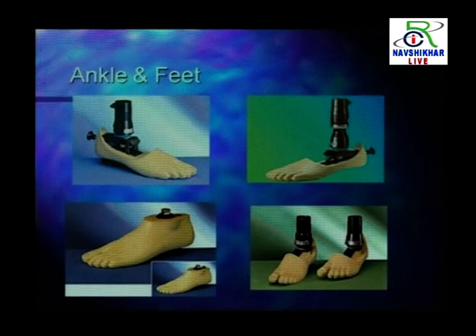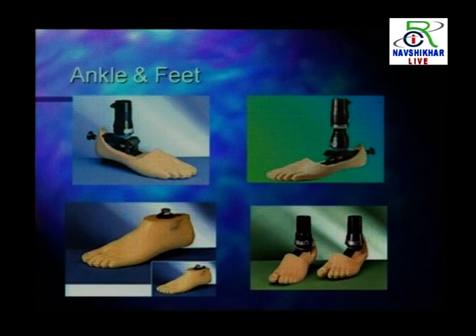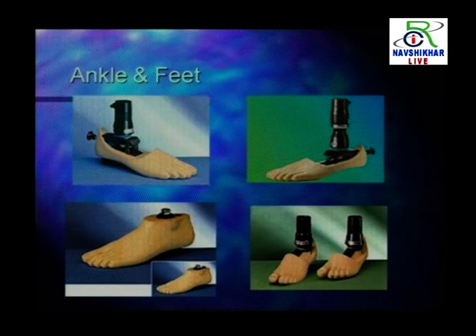I was talking about the energy saving feet. Different manufacturers make them according to their own designs. The first one is a dynamic kind of foot with an integrated ankle, and inside there is sometimes a spring coil that gives extra push to the patient when moving. So it gives a pushback, and less energy is consumed in the process of gait. The second one is the same kind, but the third one is a simple SACH foot, only the manufacturer is different, so they make a different shape.